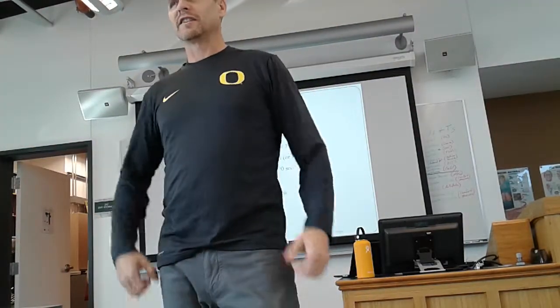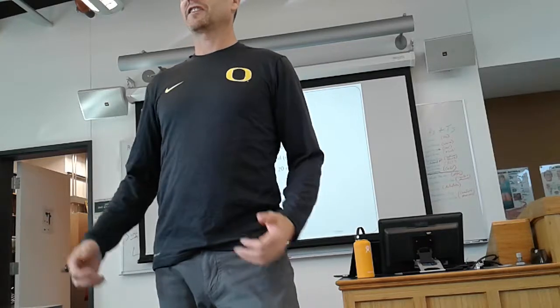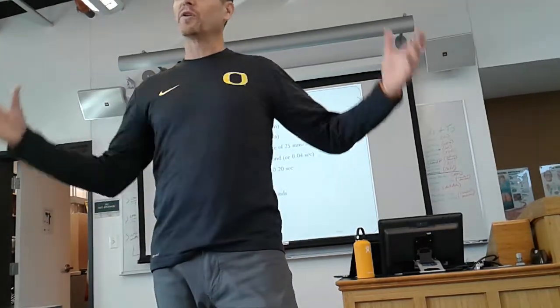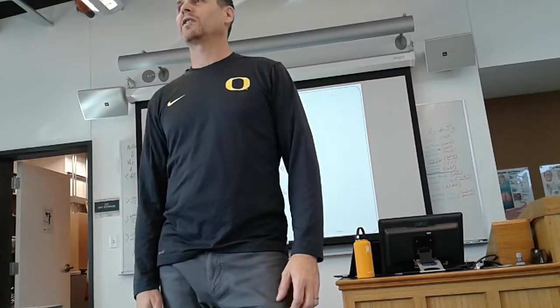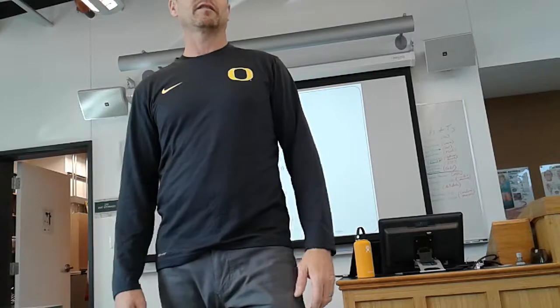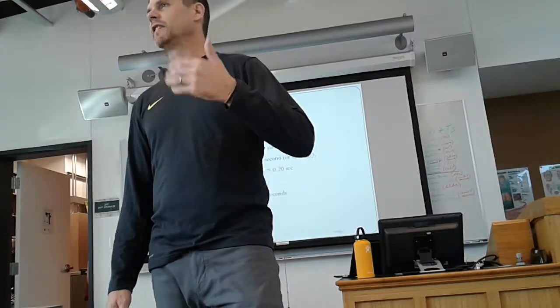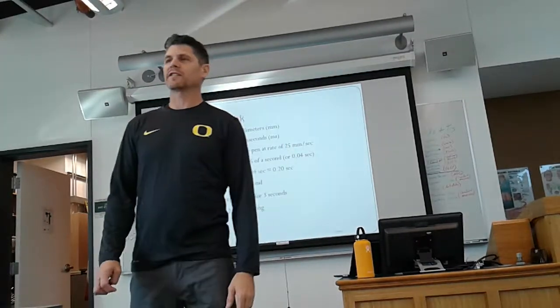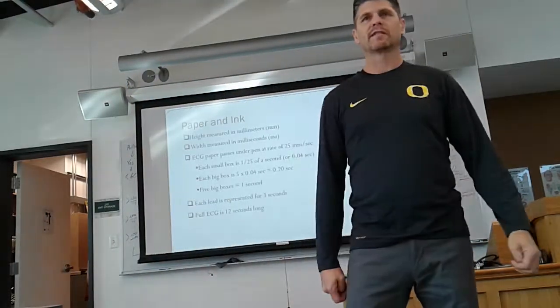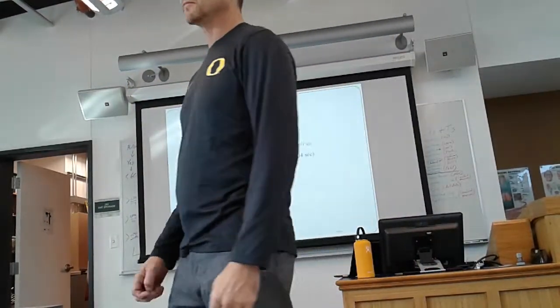And we choose 6 seconds as opposed to say 7 or 5 or 8 because 6 nicely tucks into 60 seconds. And all of the stuff that we do, everything you've learned up till now when it comes to timing of your patients, is done in minutes. Does that make sense? So it easily tucks into a multiplication factor that we can do to establish things like rate and rhythm. Questions on that?